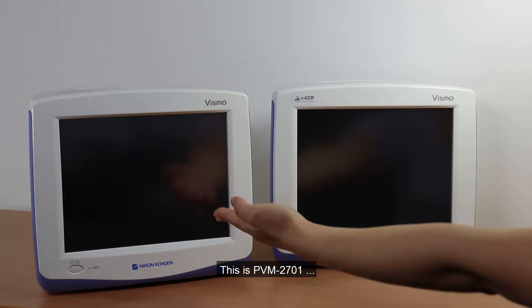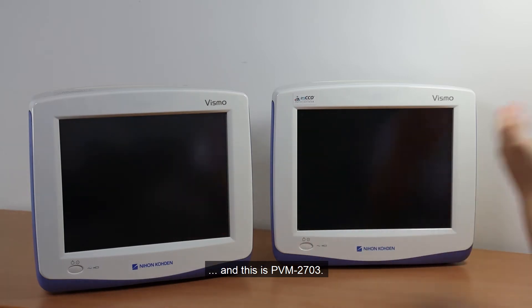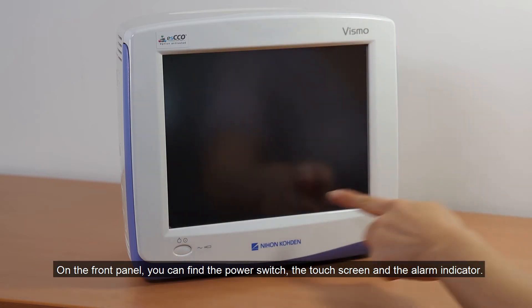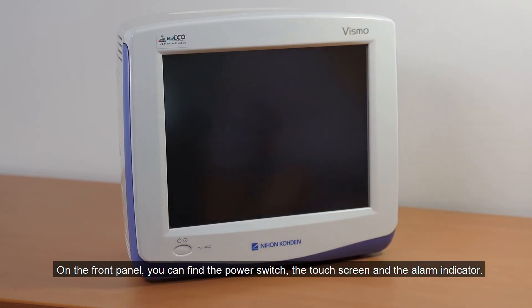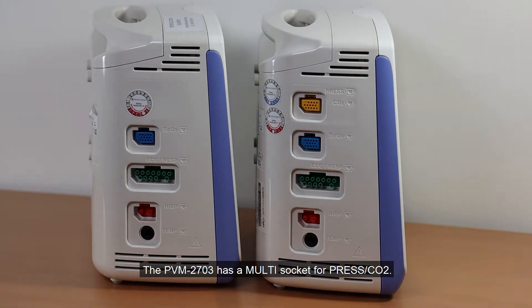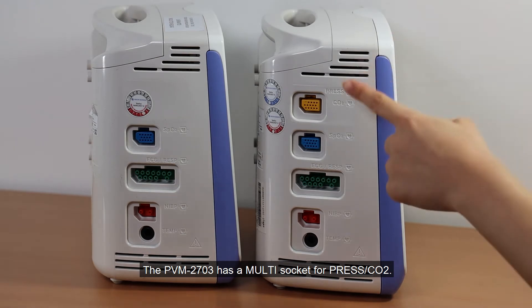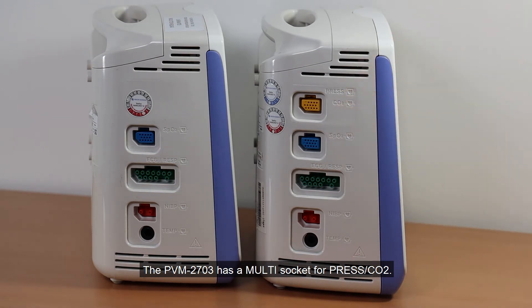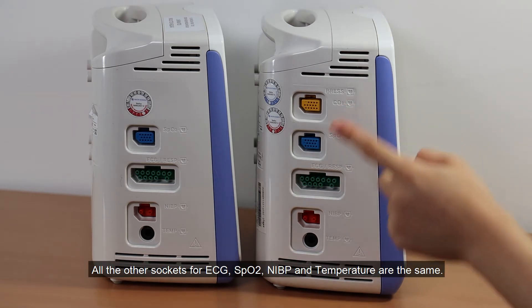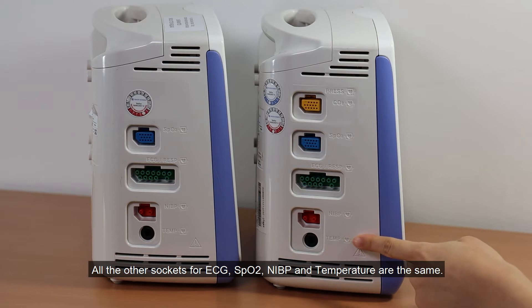This is PVM-2701 and this is PVM-2703. On the front panel, you can find the power switch, the touch screen, and the alarm indicator. The external difference between the two models is the left side panel. The PVM-2703 has a multi-socket for IBP and CO2. All the other sockets for ECG, SpO2, NIBP, and temperature are the same.